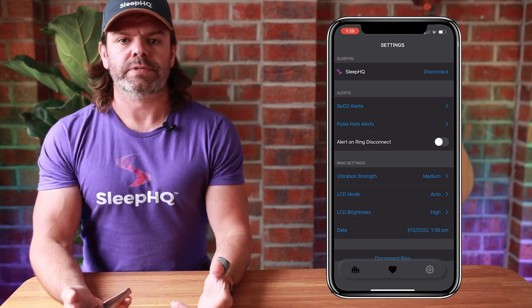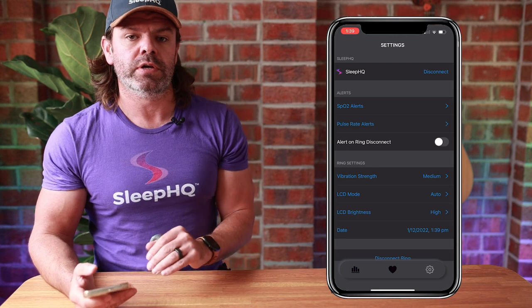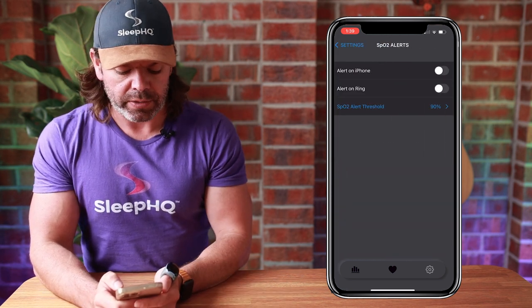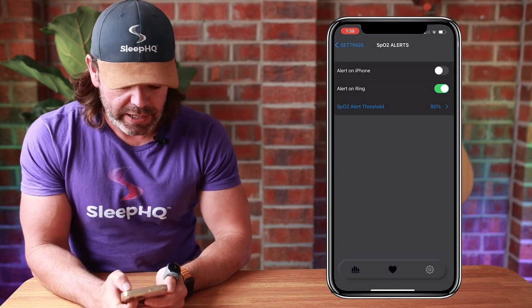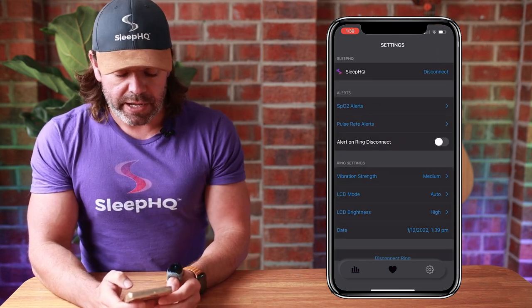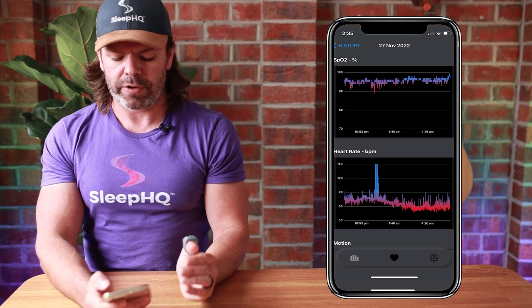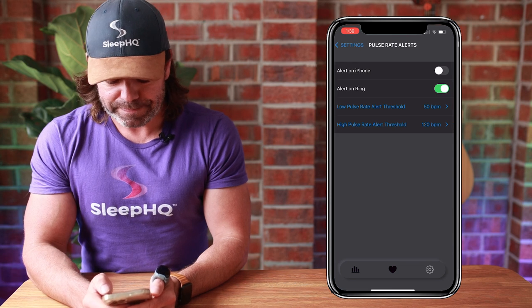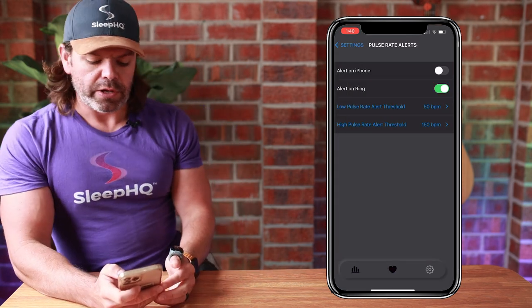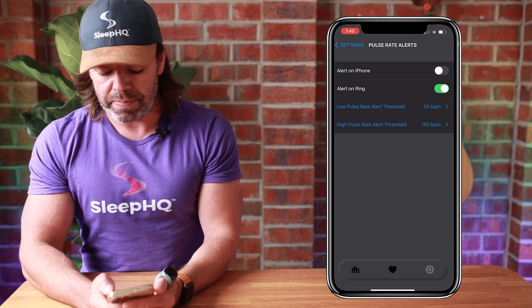Next up we have custom alerts, so that if your blood oxygen level drops below a certain point or your pulse rate goes below or above a certain threshold, you get a custom alert — the ring or your phone will vibrate. For SPO2 alerts I'll choose alert on ring, and I'll set my SPO2 threshold at 90%. I've had some trouble with my heart rate lately — it went up to about 200 BPM one night — so I'm setting a high pulse rate alert at 150 BPM and a low pulse rate alert at 50 BPM.